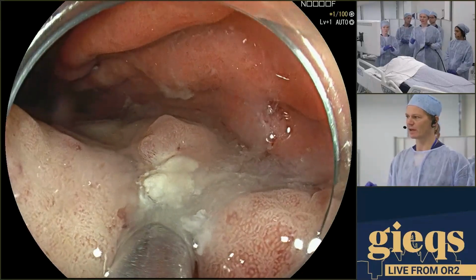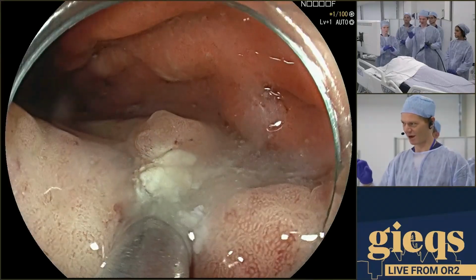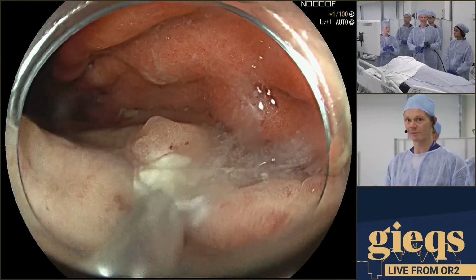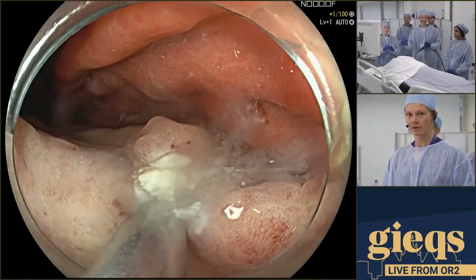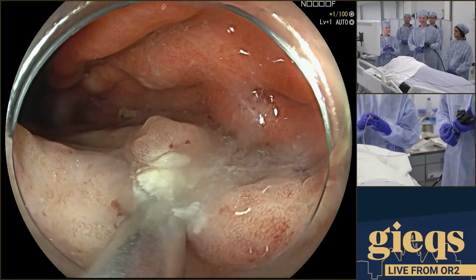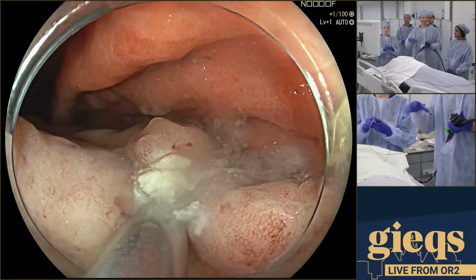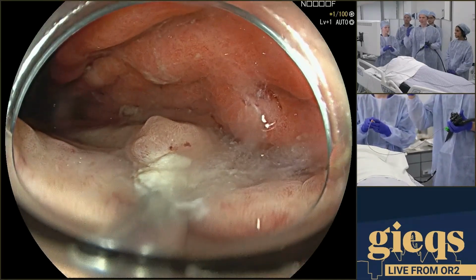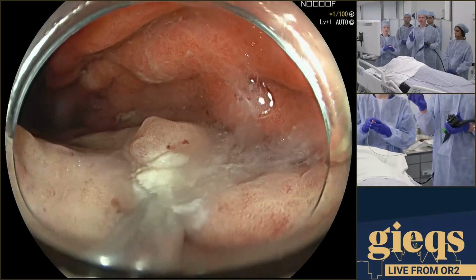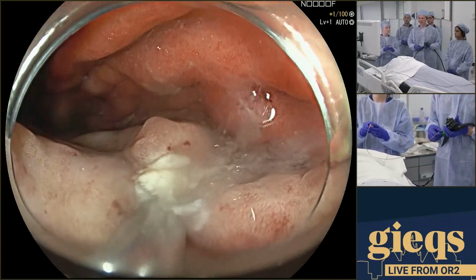In the meantime, I've demonstrated how to clip. I don't want to use too much time, but you've seen that I've rotated the clip myself as well, because this particular clip allows you to rotate yourself with your hands, with your two fingers. So we've adjusted the position. We desufflated to let the tissue get in, and despite having a tiny clip, I think that we clipped it thoroughly.